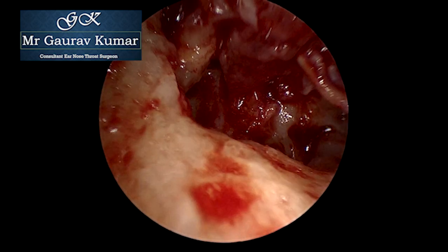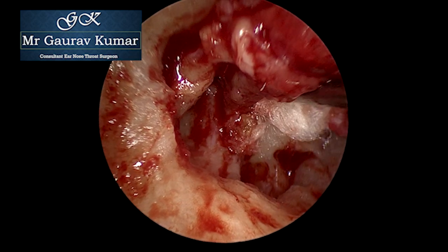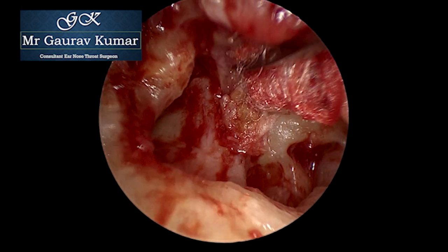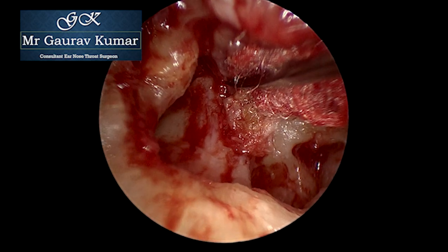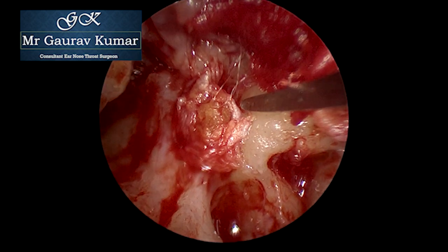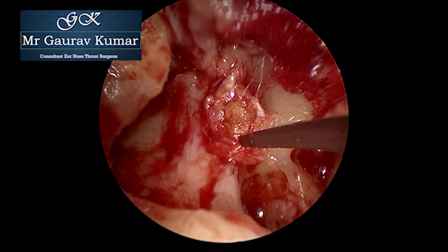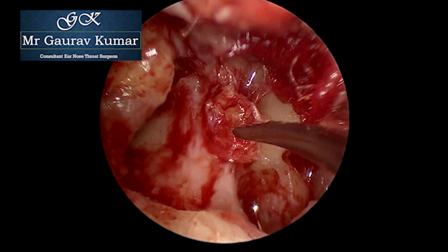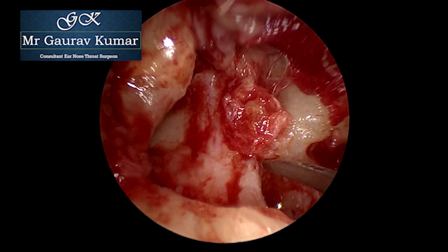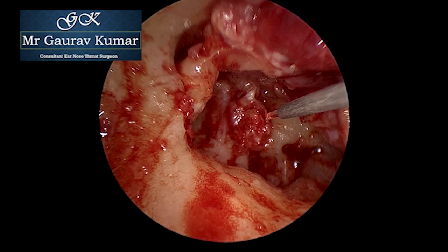Today we are going to talk about this very interesting case which was managed with posterior superior quadrant retraction pocket to the stapes head. As you can see, the stapes is totally trapped in the cholesteatoma sac. The most important tips and tricks in this procedure will be: first, the assessment and mobility of the stapes footplate.